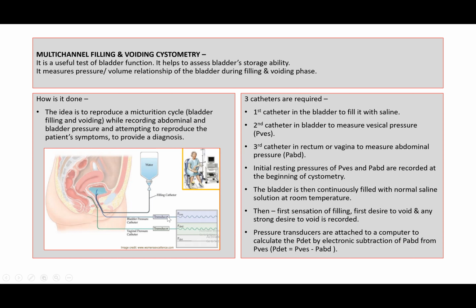And then we also have to calculate the detrusor pressure. How do we calculate it? This is calculated with the help of these pressure transducers. These are attached to the computer. You can see this computer over here. And then there is electronic subtraction.